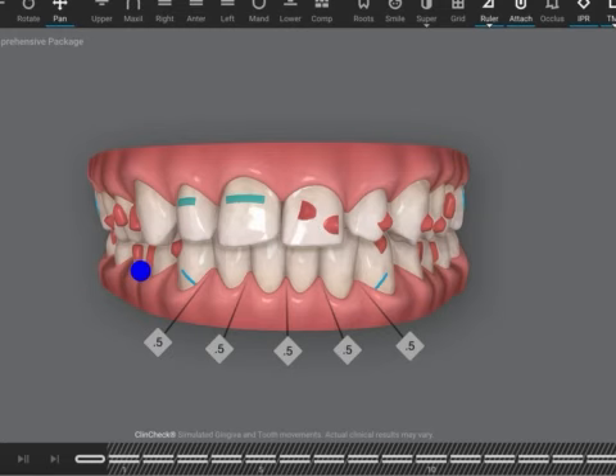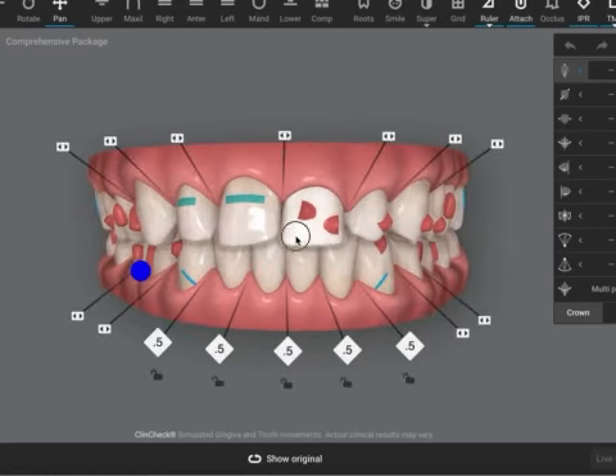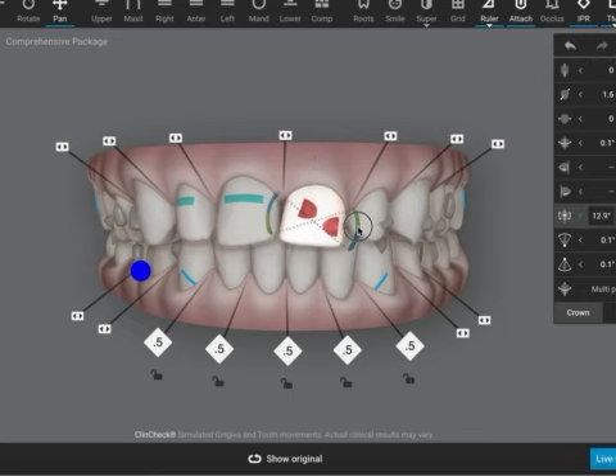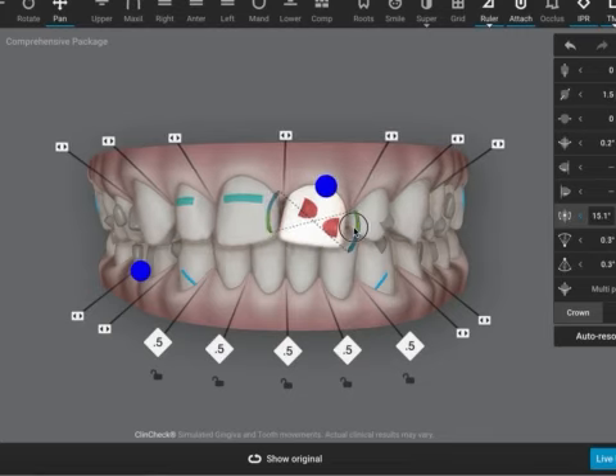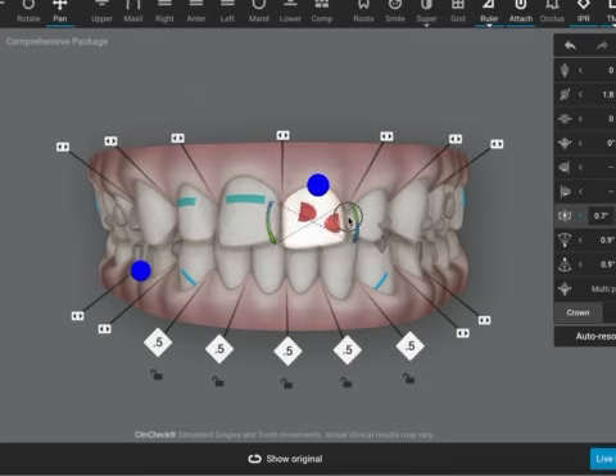We are expecting these teeth are going to tip mesially — both of them are going to. If we did nothing, they're going to look like this. So I'm going to have to ask the technicians to move these teeth bodily, then every alternate aligner add mesial root tip or distal crown tip to correct it, because as the tooth moves mesially it's going to tip. So each time we move it mesially, we need to apply the anti-tipping correction to push it back.